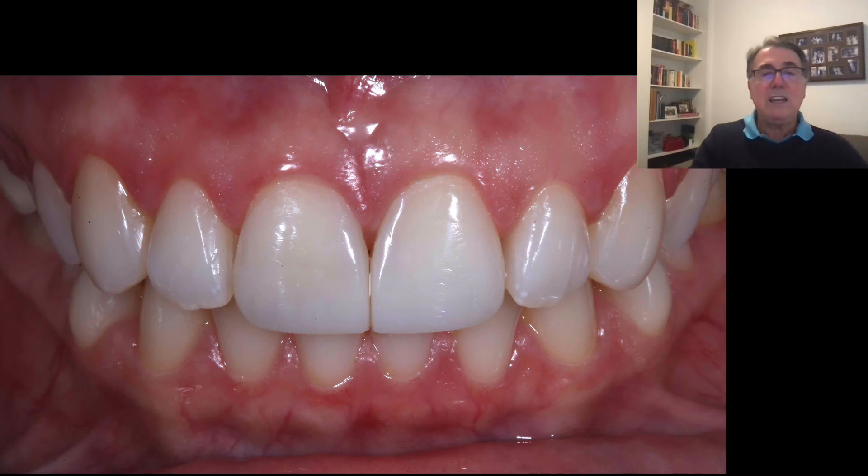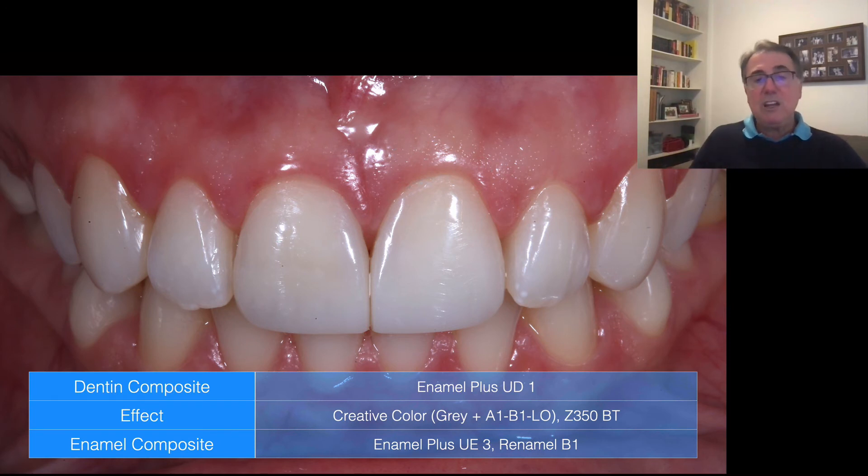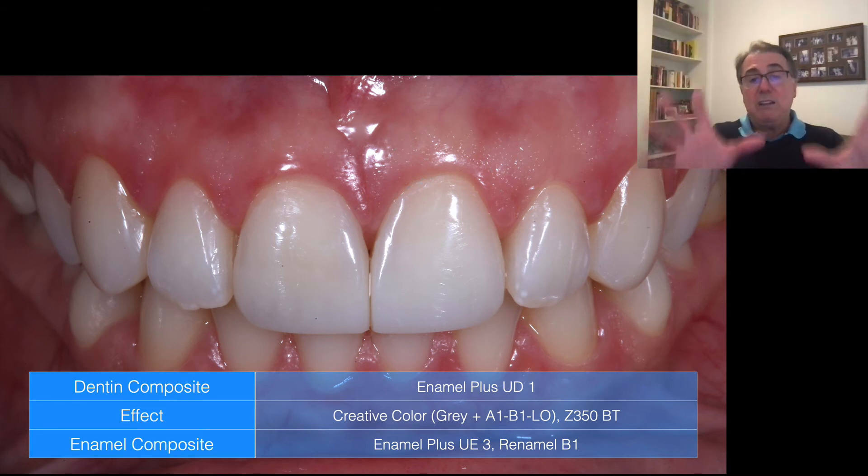This is the final restoration — and here I also have the canine restored already. These are the materials I used: on the palatal shell, Enamel Plus HRI Universal Enamel 3 which is the high value. Then dentin composite — Enamel Plus Universal Dentin 1. For the effects, I used the Creative Color gray tint and the A1B1 LO opacifier. I used the Z350 — which is the Filtek Supreme BT, blue translucent — to make the opalescent effect. And on the top, veneering the whole tooth, I used the Renamel B1.